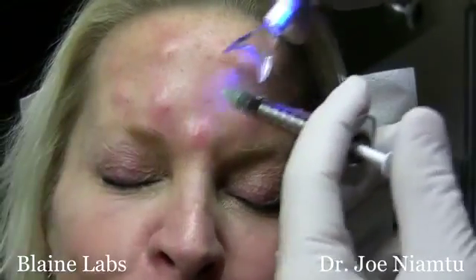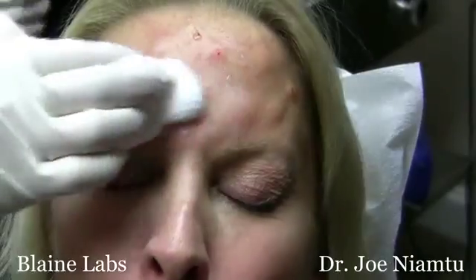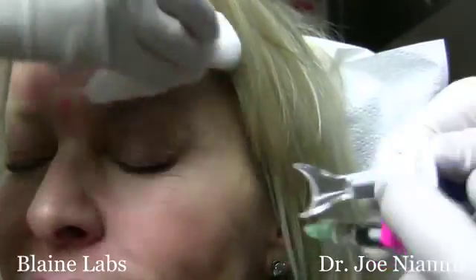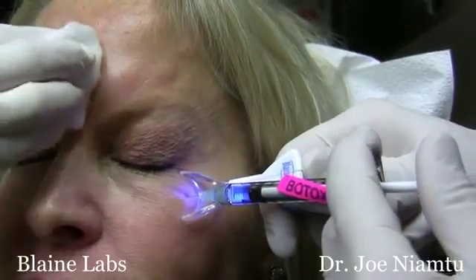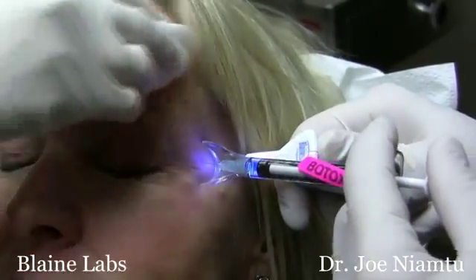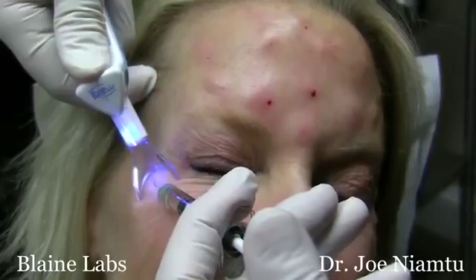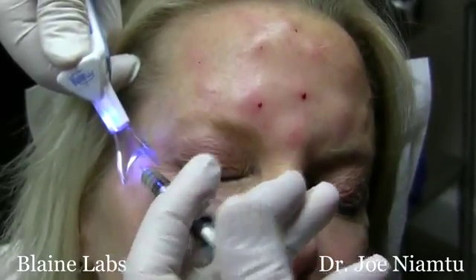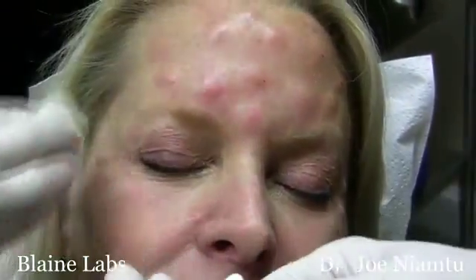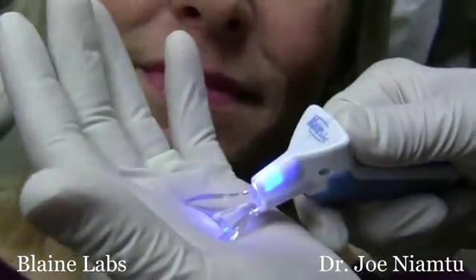And when I get Botox, I'll tell you right now, I make my nurses use it because I think it makes a difference. Basically, it's the gate theory of pain control. The thalamus in our brain is what senses pain, and there are inhibitor neurons that are stimulated from a vibration source. To simplify it, it's really difficult for the brain to interpret two different stimuli at one time. And what happens is this is naturally a distraction to the patient. So when we're turning this on, it's vibrating, it's making some noise, and it's a distraction, and that helps as well, but there actually is science behind it.